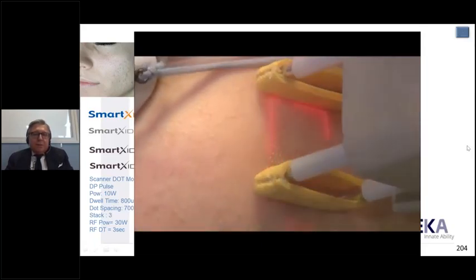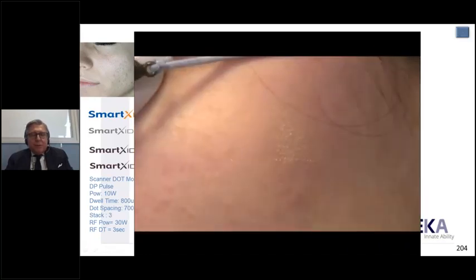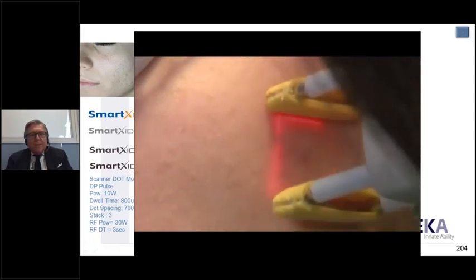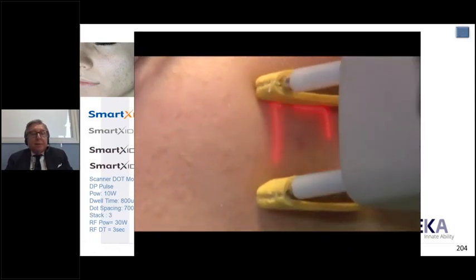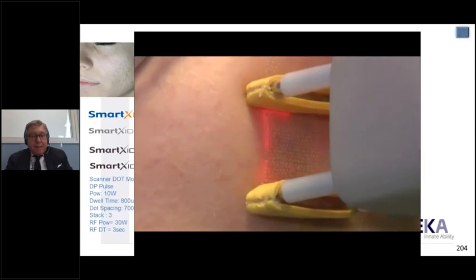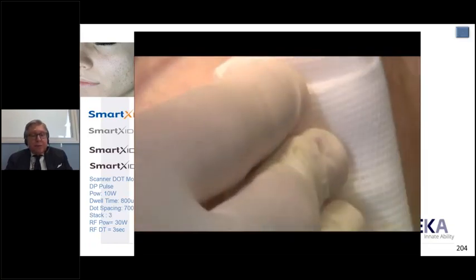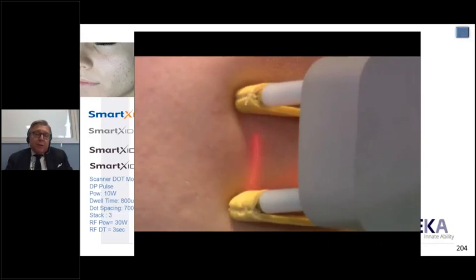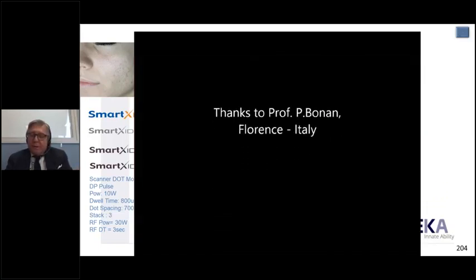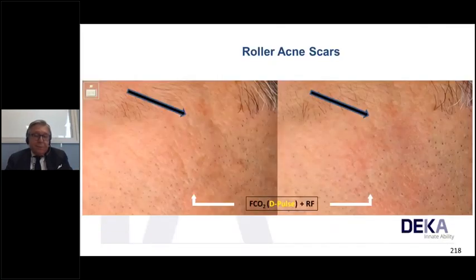What is important is to treat the patient with a laser in the cold situation, not when there is acne in the inflammation phase. Only in the post-acne scar can we use the treatment. Otherwise, we risk having a flare-up, so the recurrence of the acne in the inflammation phase.